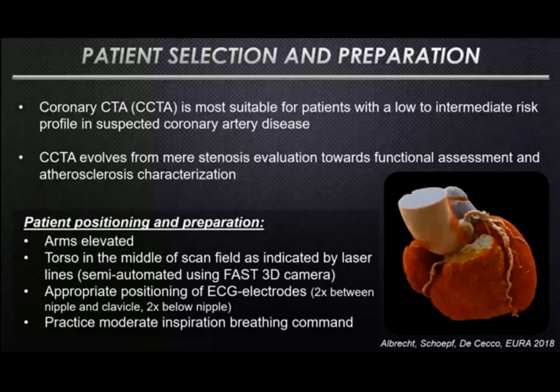And CCTA has the main advantage over catheterization that you can visualize the surface of the vessel and also really analyze the wall and cross-sectional images, and this is not possible with catheterization. And in addition, it moves towards also cardiac MRI techniques with functional assessments possible and further atherosclerosis characterization. Most important for getting started is to know how to appropriately position and prepare the patient.